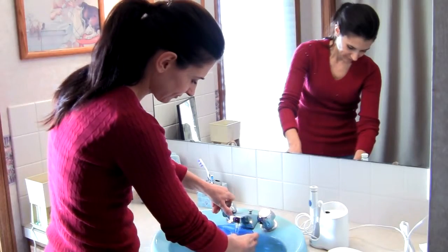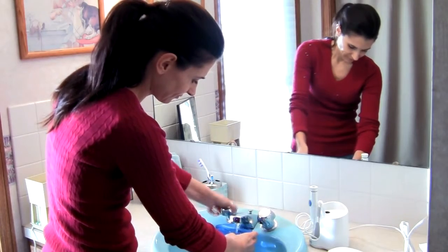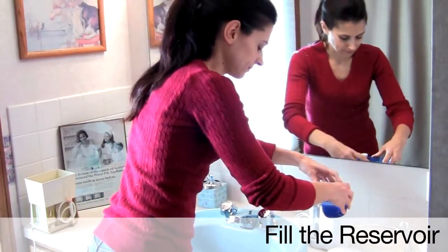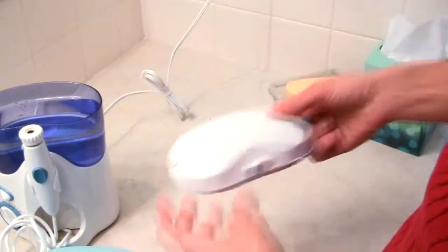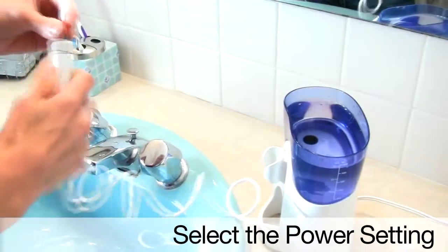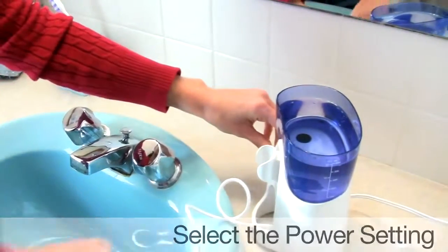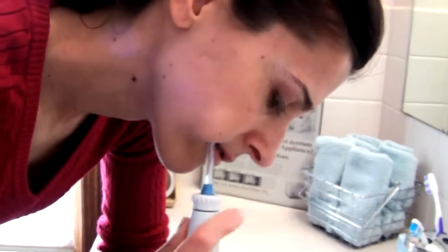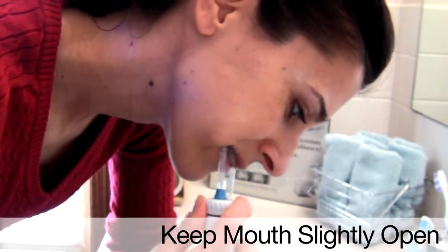This demonstration shows an easy and mess-free technique for using the Waterpik water flosser. Fill the reservoir with warm water. Select the tip you want to use. For regular daily use, I use the jet tip. Select the power setting. Lean over the sink. With the tip placed in your mouth, turn the unit on. Keep your mouth slightly open to allow the water to run out.